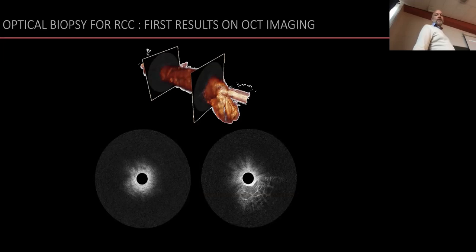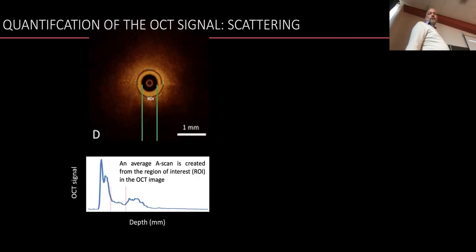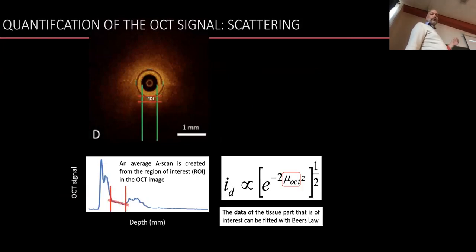Again, some examples of how we do that. Of course, we do it in 3D. We take this pullback. If the tumor size is long enough, you have a full tumor in there. And again, this gives you an example where we can study the attenuation coefficient. We can do that nowadays over the full rotation, over the full pullback. You get a three-dimensional attenuation map of your tissue under study, and it tells you something again about the grade.